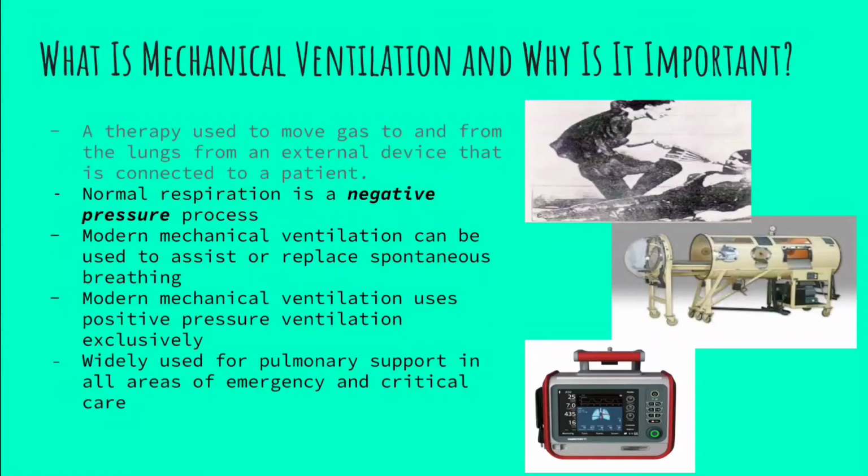So modern mechanical ventilation is something that we're using to assist or replace spontaneous breathing. Now, we think that this is something that's new, just within the last 100 years or so. And that can't be more false.